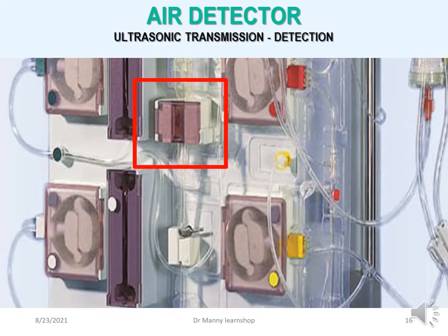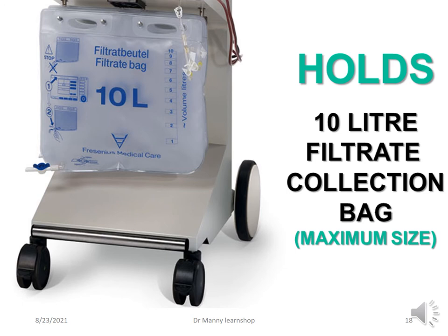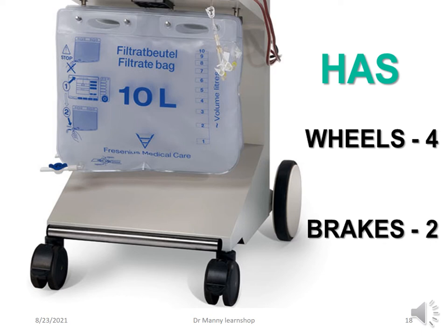The air detector uses ultrasonic transmission as the detection mechanism. If any air is detected, it will alert. At the bottom you've got hooks and scales 3 and 4, which are for accurate fluid balancing and holding the filtrate bag, holding approximately 10 litres of filtrate at maximum. The unit has four wheels and two brakes.